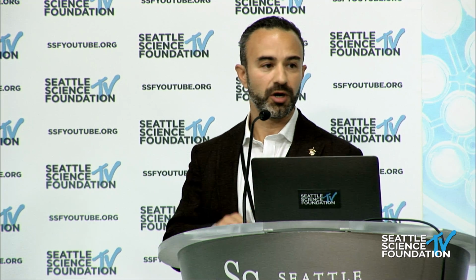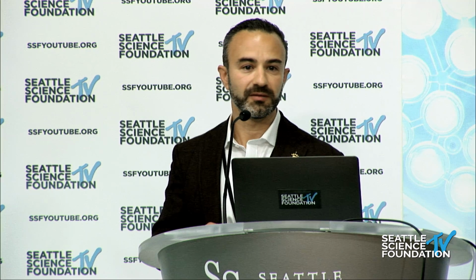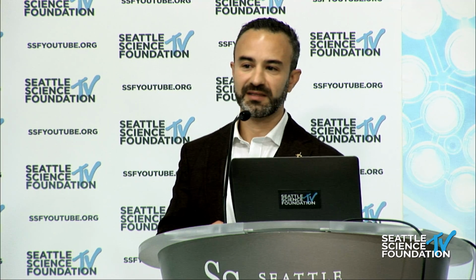In a couple of the pictures also, we use a large footed distractor to distract and break those posterior osteophytes. I do not regularly take the PLL. However, I do scrape the PLL with a curette and make sure there are no bony osteophytes, as Steve mentioned, posteriorly, because they can impact into the canal.